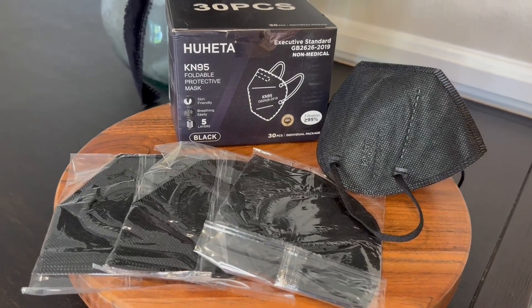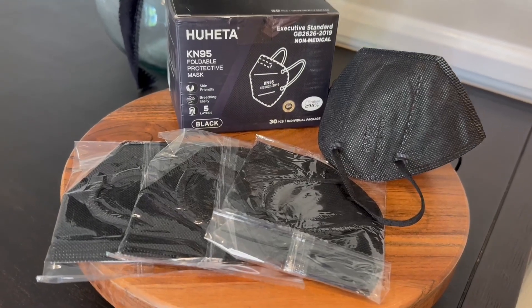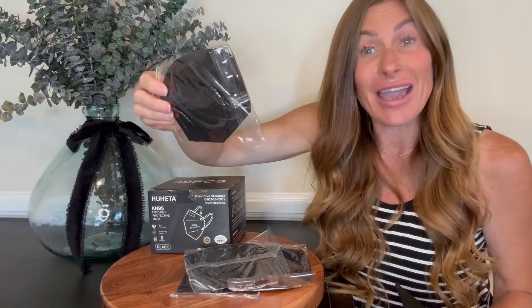So first off, this is a set of 30, and I want to point out that they each come individually wrapped, so you know that when you open it, you are the first person handling or touching the actual piece of this mask.